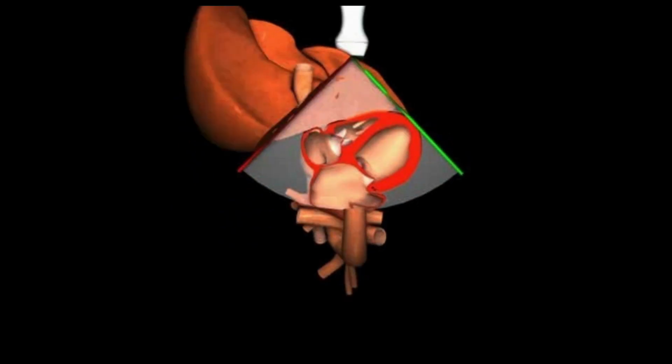Let me pause the video right here because this is a perfect picture. So green line, probe marker, therefore whatever structure is sitting closest to that green line is going to appear on the right side of the screen, right? So in this case, it's going to be the apex of the heart.